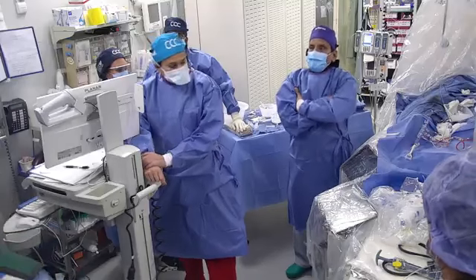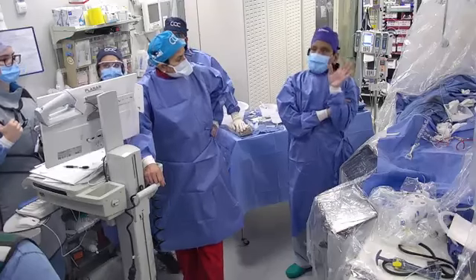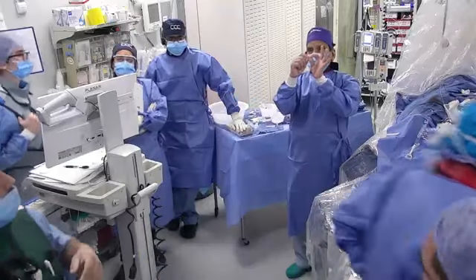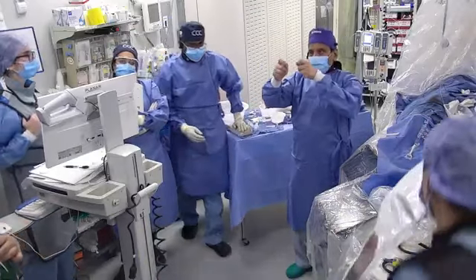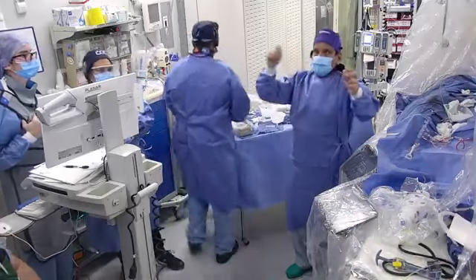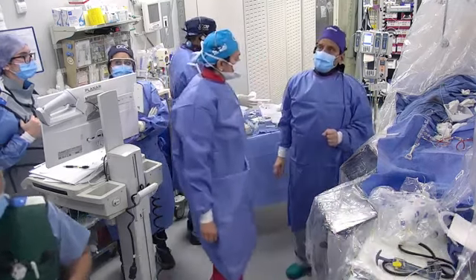You know, we had the micro crown. Their speed was 40,000 and 80,000. But the problem was, they put an ablative surface at the tip, then a gap, and then the crown. So what was happening is that it was going into the lesion and torquing in between that gap. It was not a continuous diamond chip, so that device has been discontinued.